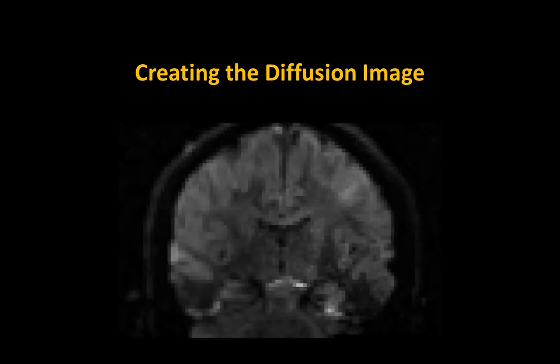Okay, so to give you some background about what we're dealing with, you've probably already come across magnetic resonance images, right, and some of what we've talked about so far. These are essentially images of the brain. They're non-invasive, but we can construct them by using some properties of magnetic resonance physics.